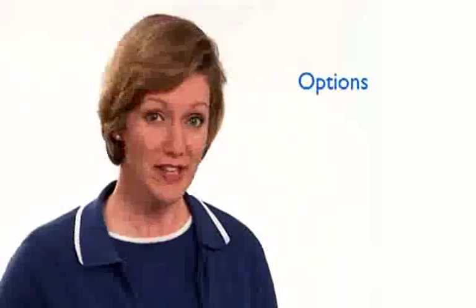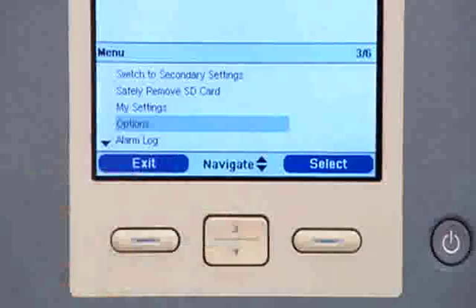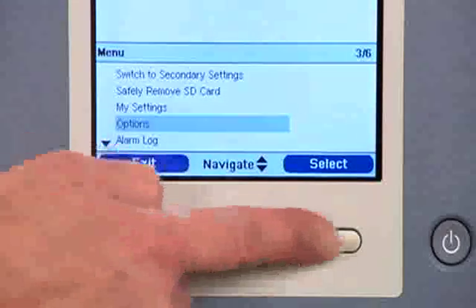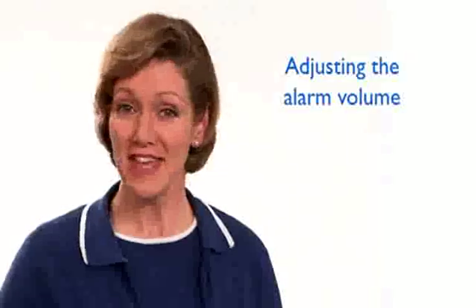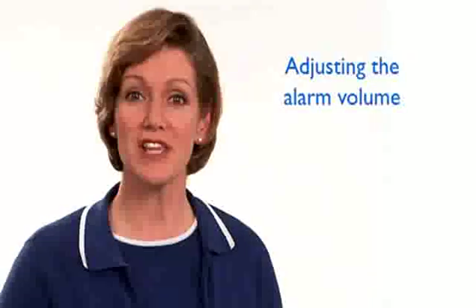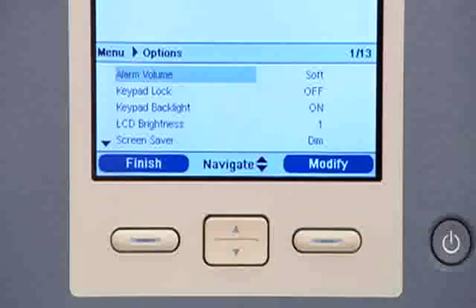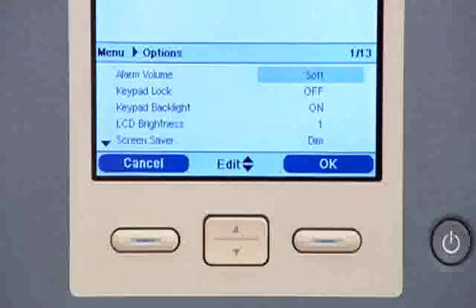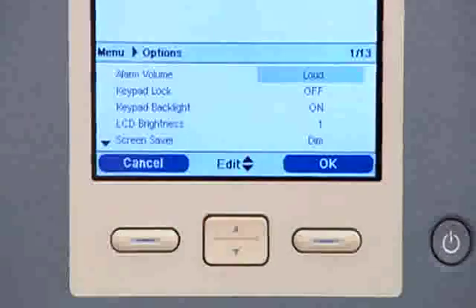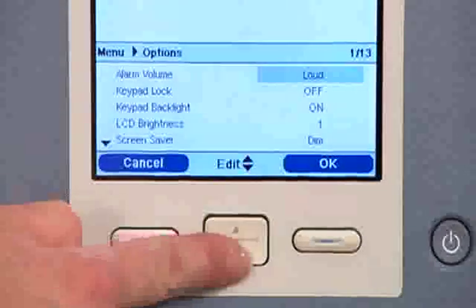There are a variety of options you can set with Trilogy 100. From the menu screen, use the up-down button to highlight Options and the right button to select. In the options menu, you can view and change the alarm volume and keypad lock. To adjust the audible alarm, highlight alarm volume and press the right button to modify. Use the up button to change to loud and the down button for soft. Press the right button to confirm your selection. The display will return to the options menu.